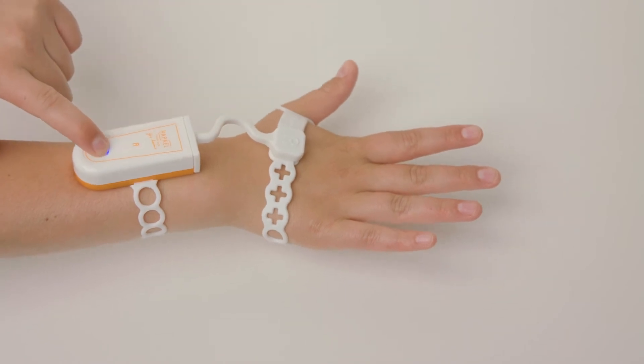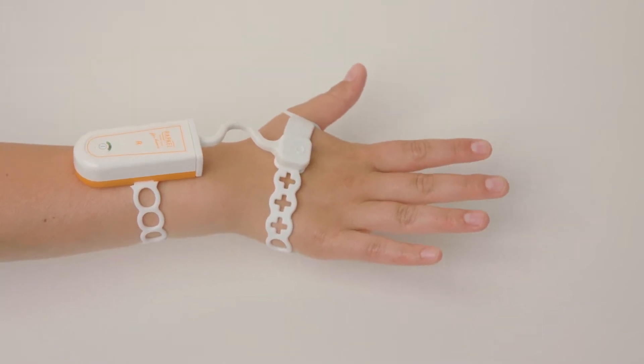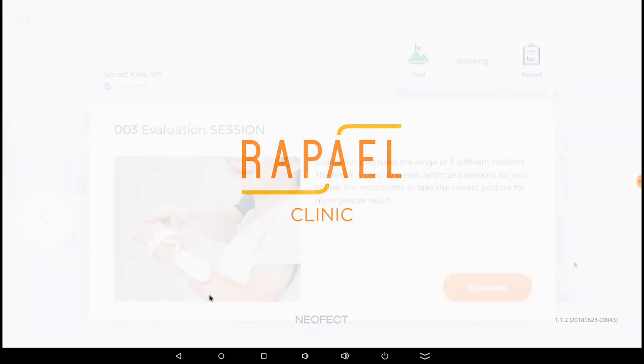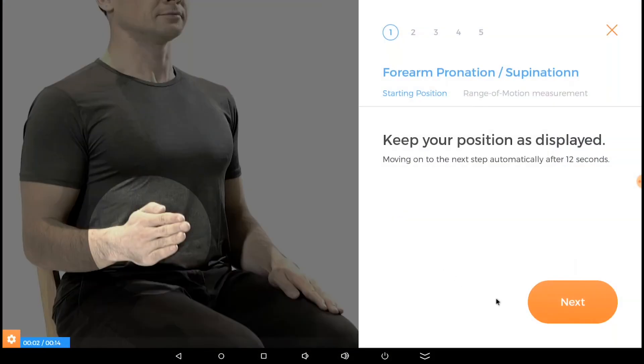Once the glove is on, press the power button until it glows green. Then start up the Raphael Home software app on your tablet. Press the orange Evaluate button to begin.